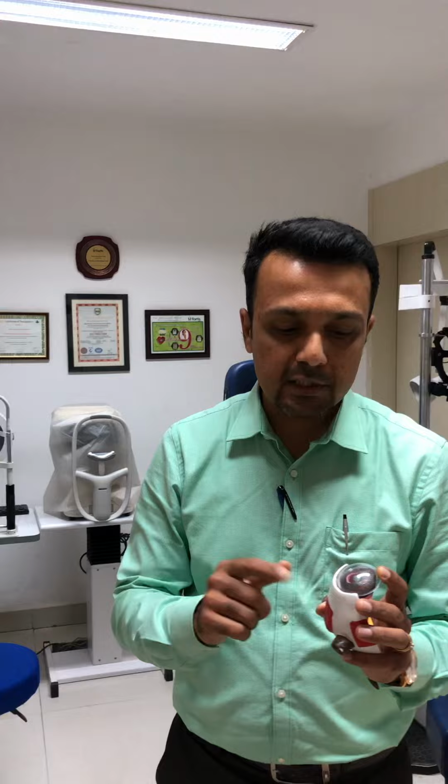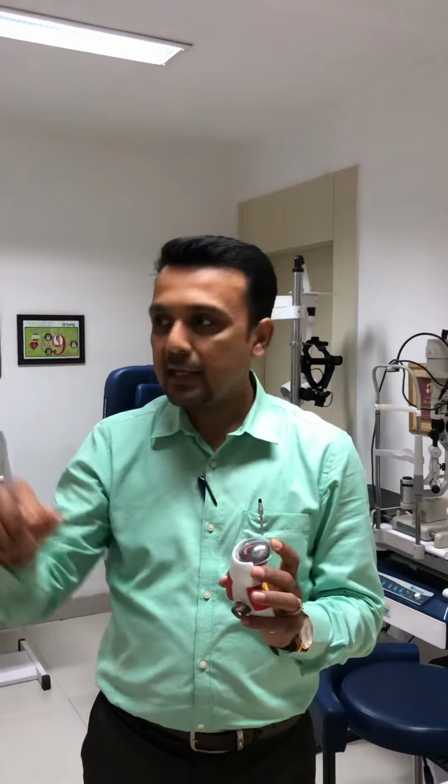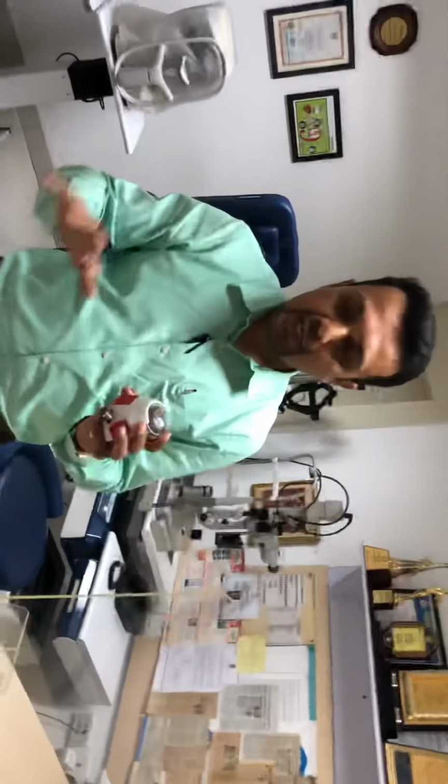The entire procedure is done by the machine. The patient has to look at the light, which is red in color, and our job is to tell the patient to look at the light, enter the power in the machine and press the foot pedal. That's it. So that makes the procedure very simple, straightforward, very safe, and it is considered to be one of the safest procedures in the world.